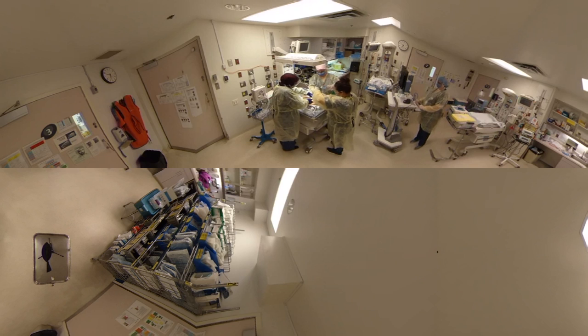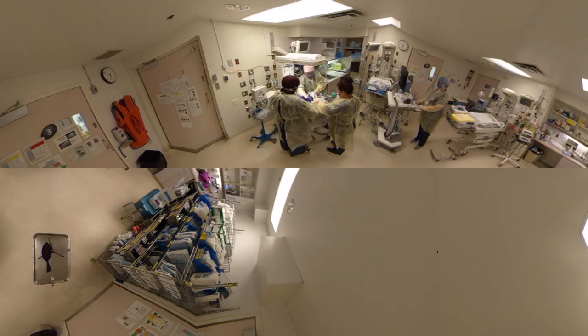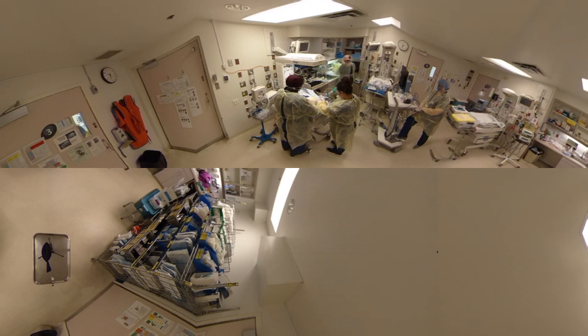Your filter's still on. You can't take over the bagging yet. One and two and three — chest compressions ongoing. Stop — the heart rate is 110 now, so we can stop compressions. Let me get this IV in. We're going to put the IV in, and we're going to have an X-ray probably to verify the IV position. Then we'll transfer the baby to the isolation room in the NICU.